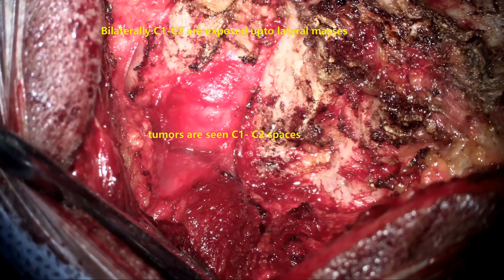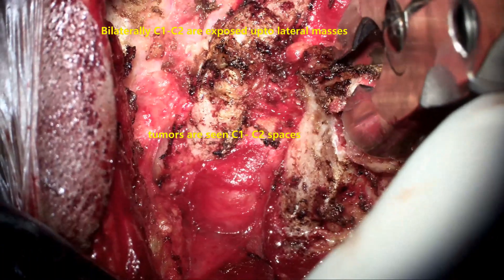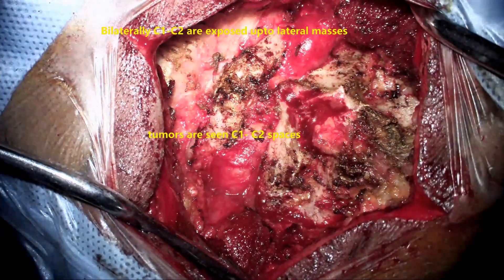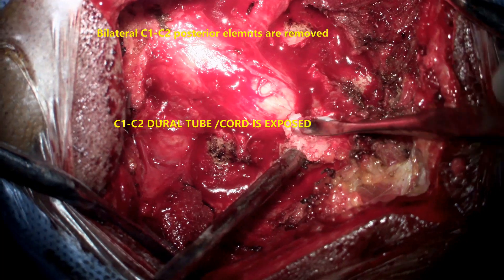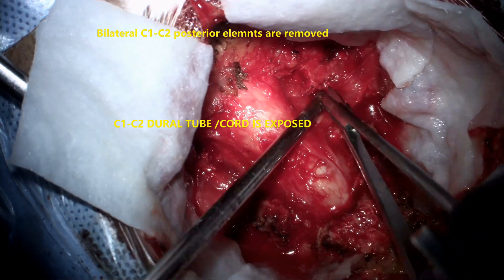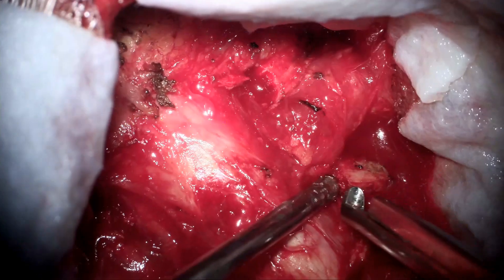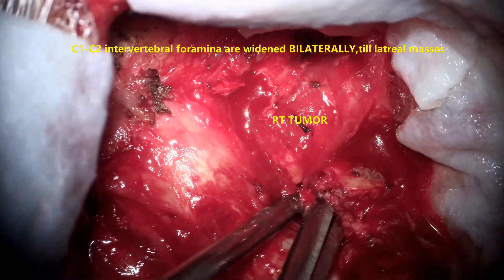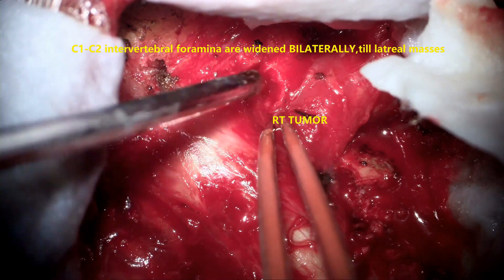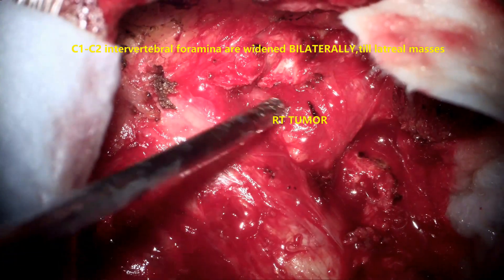The structures are separated from the dural tube and both C2 roots on the right and left sides are exposed. The C2 spinous process is removed and C2 laminectomy is done on both sides. The C1 posterior arch is removed to expose the roots completely up to the lateral mass. The lateral part of the C2 laminae is taken out up to the facet joints and the C1 posterior arch similarly up to the lateral mass, fully exposing the tumor on both sides.